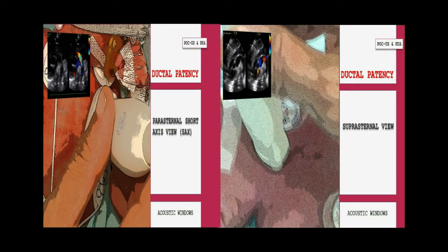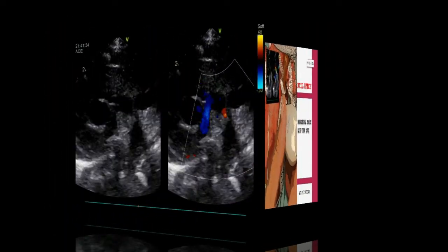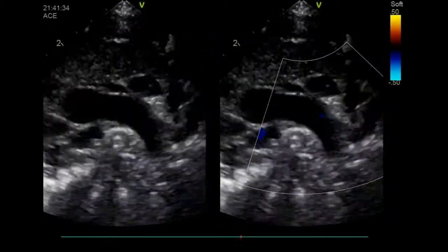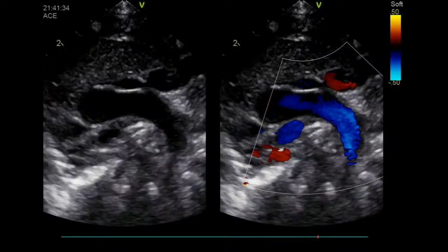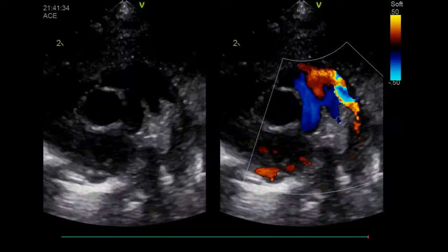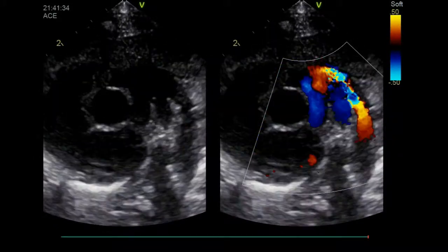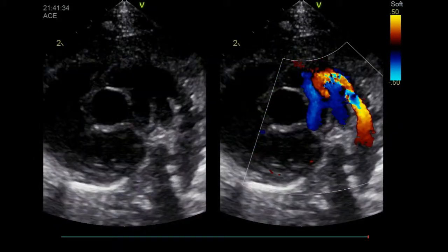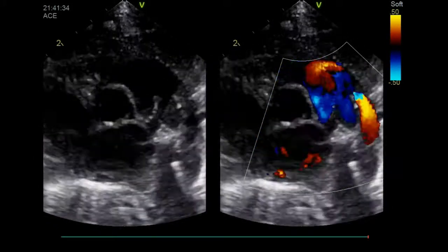Patent ductus arteriosus can be seen on each of the classic echo views, but the most preferred views are the parasternal short axis view and the suprasternal view. With the parasternal short axis view, the DA is visualized at the base of the heart by moving the probe slightly anteriorly toward the pulmonary artery.